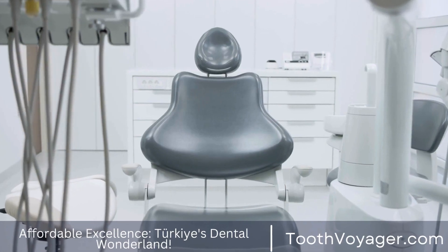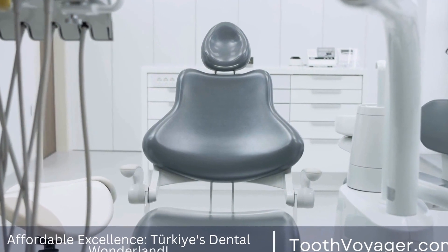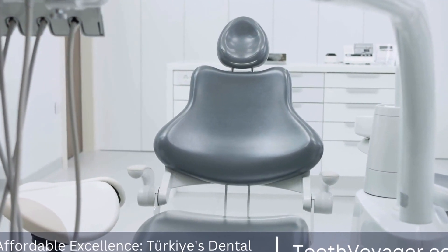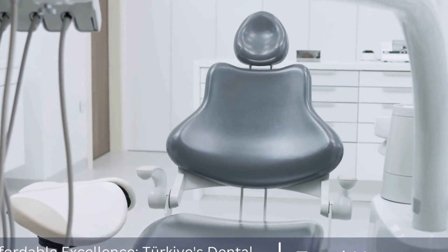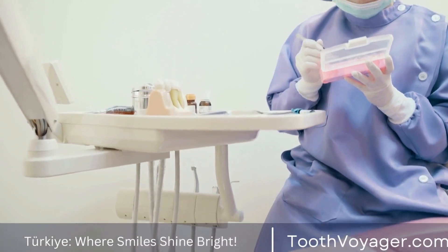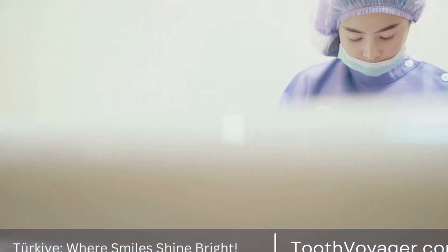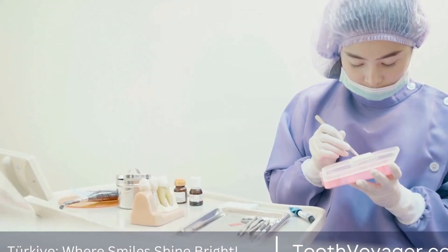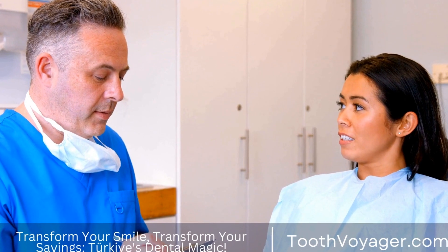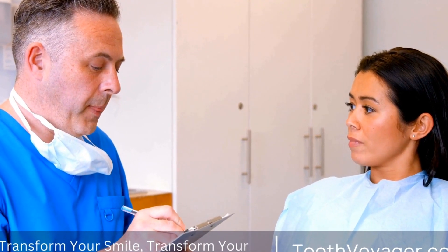Before permanently bonding the veneers to the teeth, the dentist will clean and etch the teeth to create a strong bond. They will then apply a special adhesive and carefully place the veneers on the teeth. A curing light will be used to harden the adhesive, securing the veneers in place.